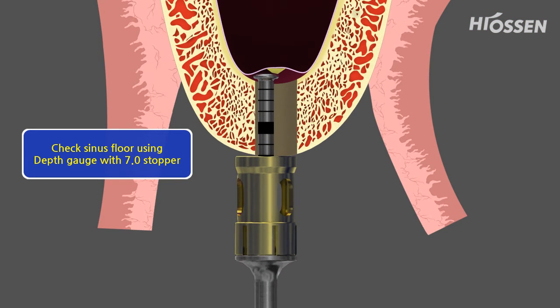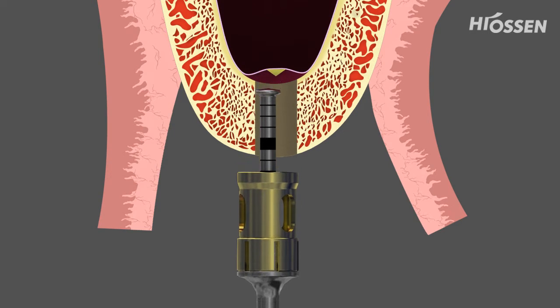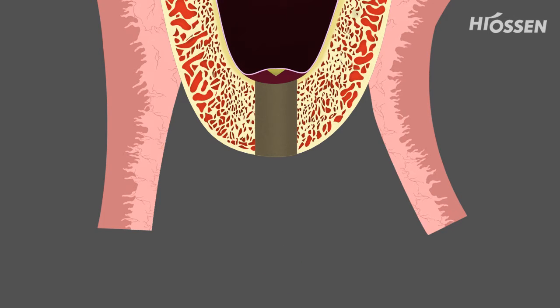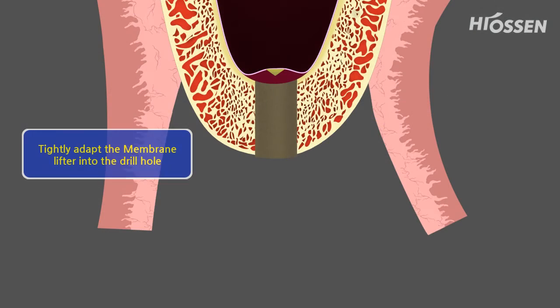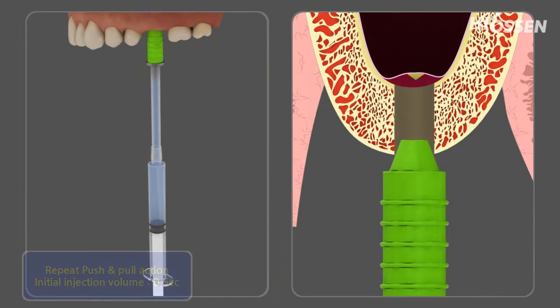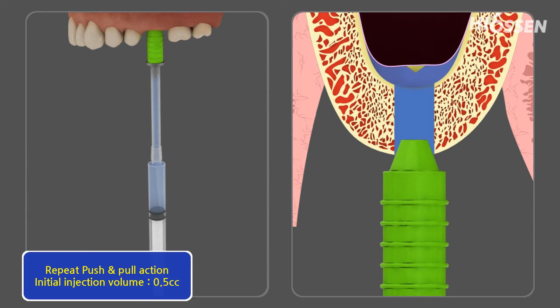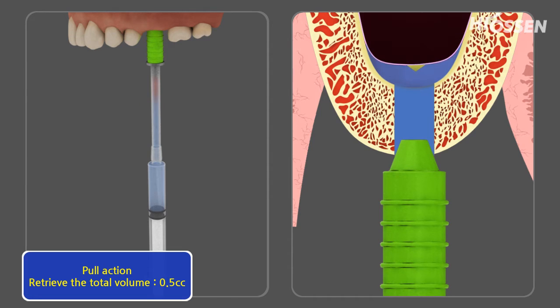By using the depth gauge with the 7 mm stopper, the mobility of the membrane is being tested. Saline solution is being filled into a 3cc syringe to slowly make the hydraulic lift of the membrane. The hydraulic lifter has to fully cover the drilling hole in order to have the needed pressure for lifting the membrane.